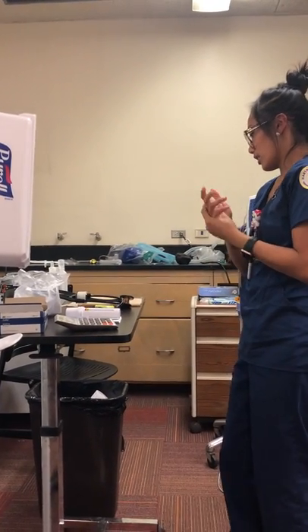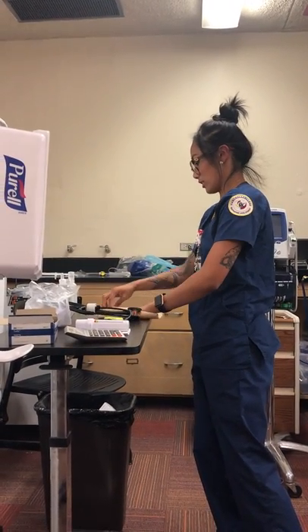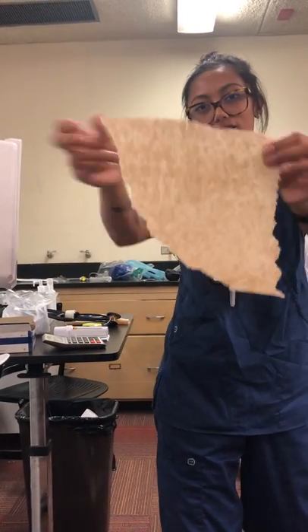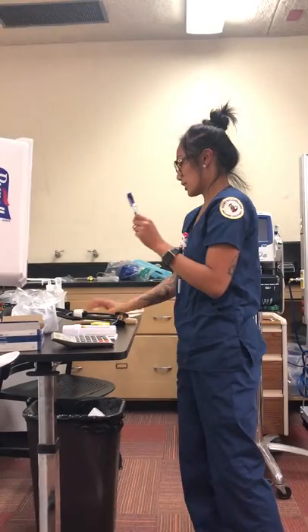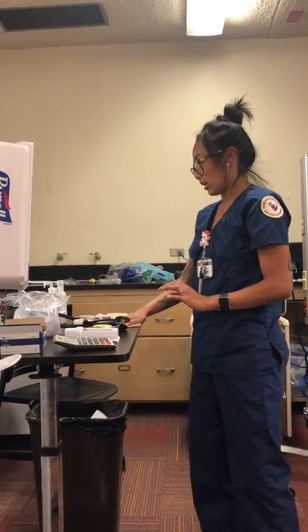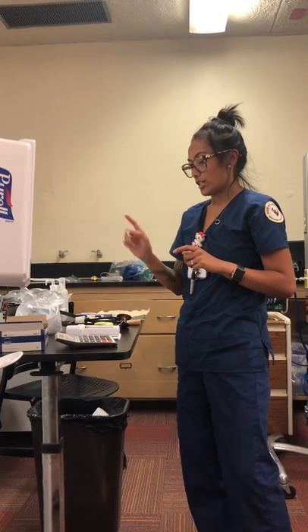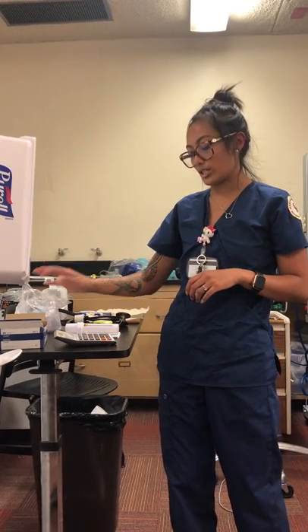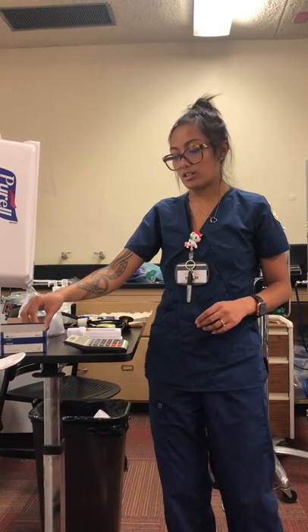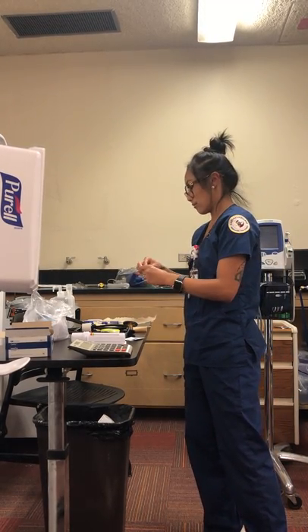I'm going to start by sanitizing my hands and gathering my materials. I will be needing a piece of paper, a pencil, my medication, some sterile water, a napkin for the patient to cough in, some gloves, stethoscope, pulse ox, small volume nebulizer, my peak flow meter, a calculator, and some alcohol pads. I'm going to use some to clean my stethoscope.